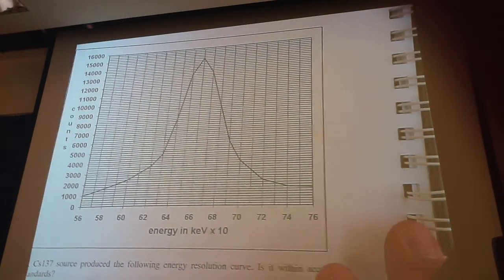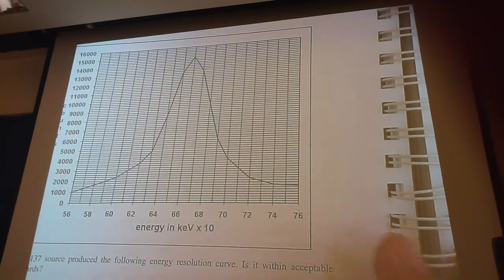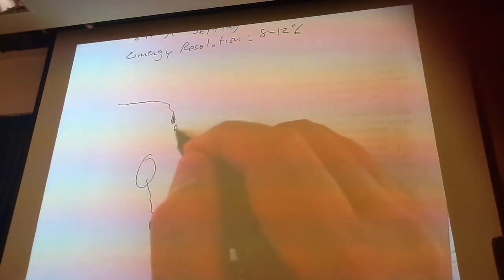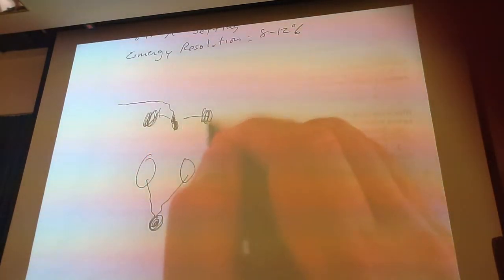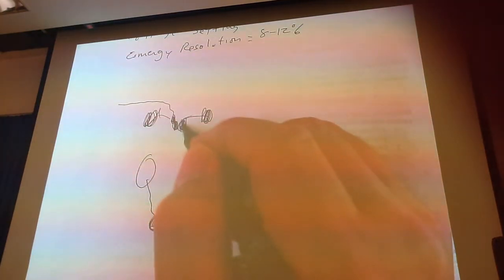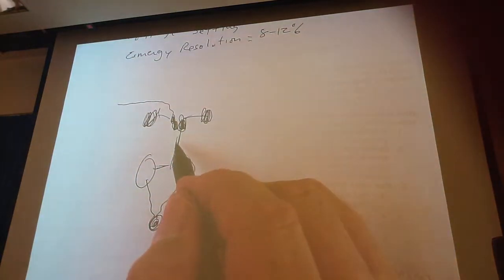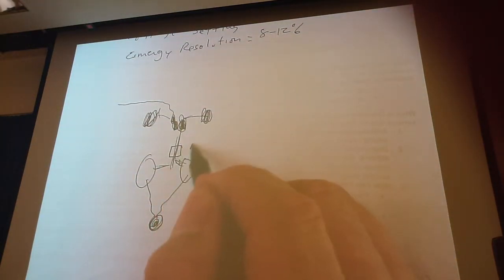When you guys do a flow study and you're looking at the kidneys or you're looking at the heart, we do the same thing. Now let's say that you're looking at the kidneys. When you're analyzing the flow study, you see the activity come in, it goes into the right atrium, right ventricle, out to the lungs, back to the heart, down the aorta, and then to the kidneys.